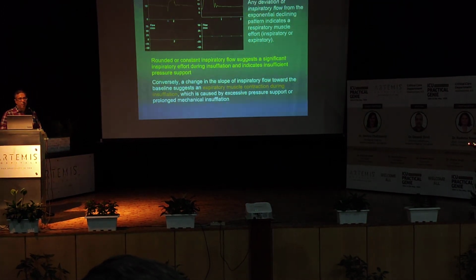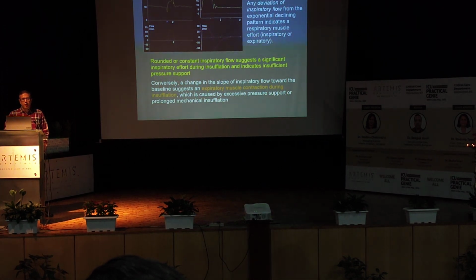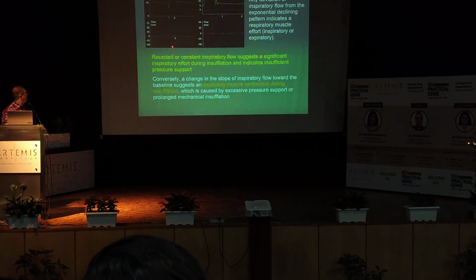So in the first graph, rounded or constant inspiratory flow is a significant inspiratory effort during insufflation and indicates an insufficient pressure support. So rounded or constant inspiratory flow.